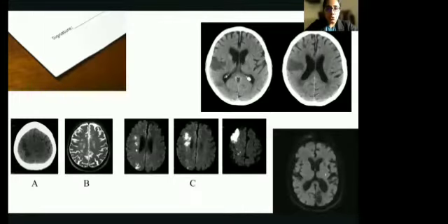Now, I am a great fan also of the signature patterns, because that leads us to the etiology. So I often go ahead and look very carefully at where exactly the infarct is, what it looks like, how it connects to the periphery, what the signature pattern is like. I'm going to go through each of the infarcts to explain what I mean by signature pattern. If you look at the first CT scan, you see almost a wedge carved across the right hemisphere. This is a classical cardioembolic type of stroke, which you anticipate.